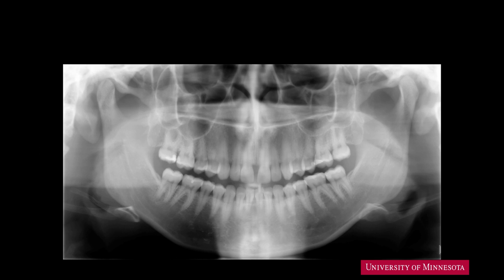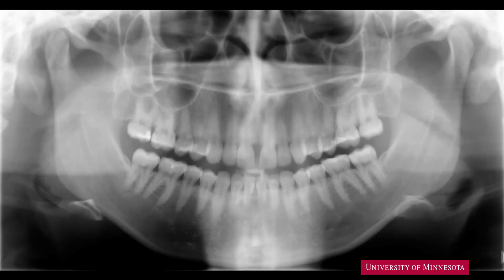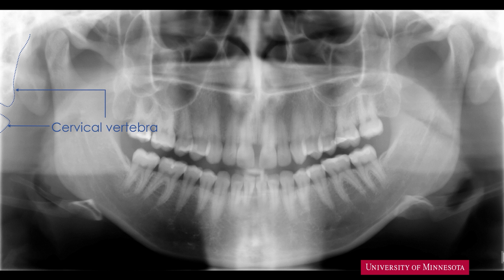Let's start from the left edge of the image, which is the right side of the patient. The radiopaque entities are the cervical vertebrae. If your patient is large, you may see only a part of the cervical vertebrae. On a child, it is possible to record a wider area of the cervical vertebrae.